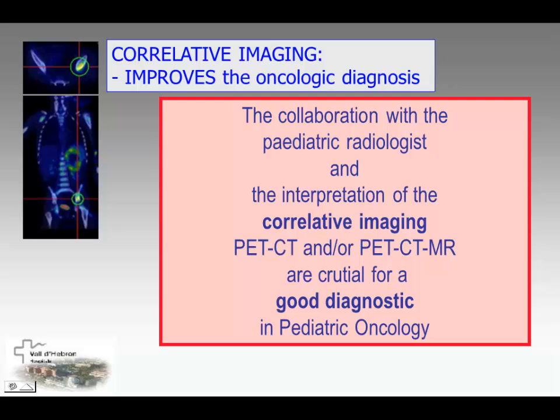Hello. I have a question for Dr. Roca. Do you have any experience with using chloral hydrate in pediatric patients? We know that chloral hydrate interferes with the FDG uptake, especially when anesthesia is not available, especially after 45 or 55 minutes from injection of FDG.